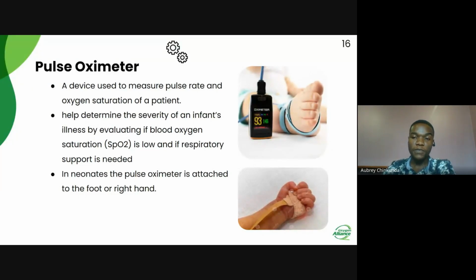So they come in different types. Others are handheld, others are fixed or tabletop. And for the tabletop, they're mainly used for continuous reading at one patient. While for the handheld, you can conduct spot readings for individual patients.